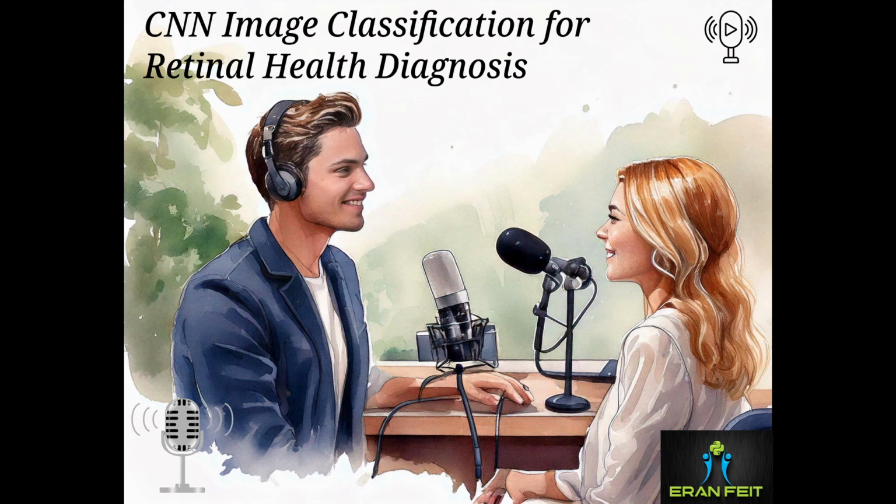Whoa, that's amazing. So how does it actually tell us the diagnosis? Does it just print out CNV on the screen? Well, the output itself is numerical, but we can easily translate that into a human-readable format. So yeah, it would display CNV. Awesome. And can we make it even more visual, like actually show the diagnosis on the image itself? Oh yeah, definitely. We can use a library like OpenCV to overlay the predicted text CNV right onto the original image. Wow, that's so cool. It's like the AI is pointing out exactly what it's seeing.